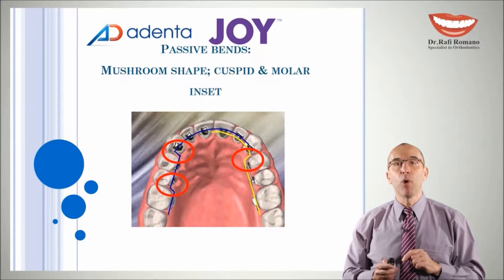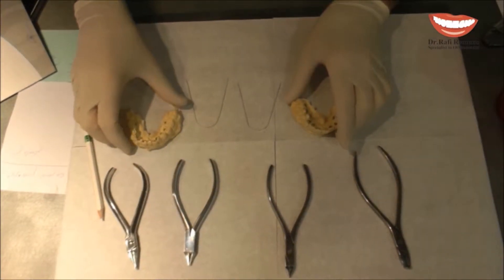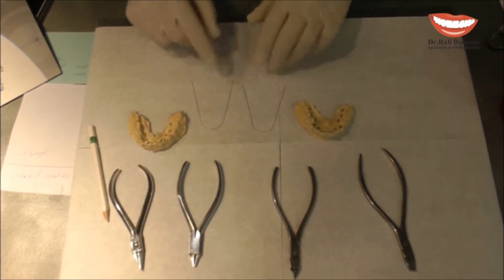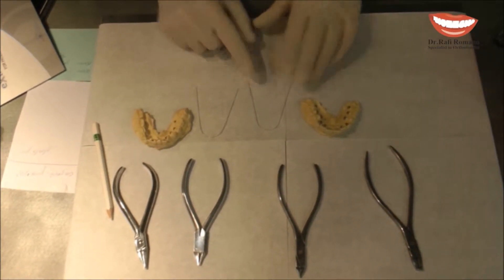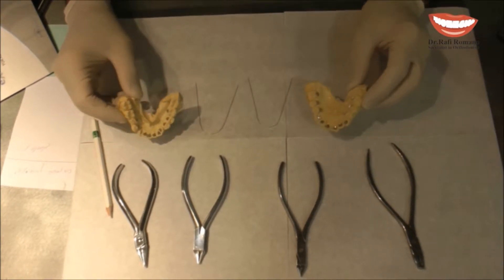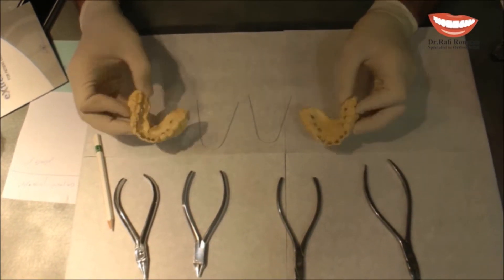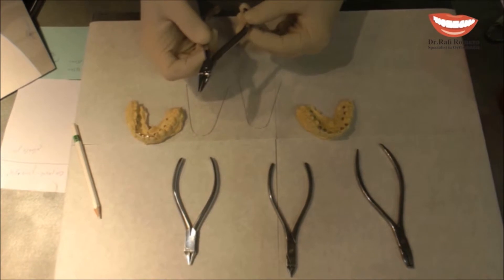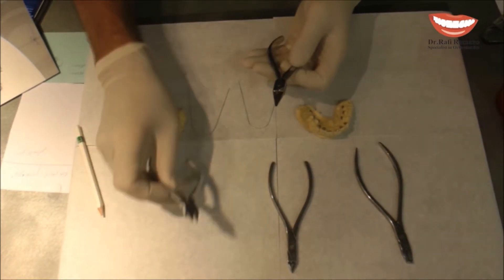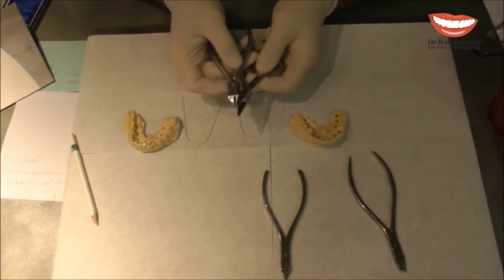You can see here the molar bend and the cuspid bend which create the mushroom shape arch wire. To prepare the first wire with the passive bends of the mushroom shape, I have two wires here — one for the upper and one for the lower — and two models with Joy brackets ready. In order to do these bends I'm using a light wire plier whose beaks are much longer compared to a standard plier, which is very helpful for lingual orthodontics.